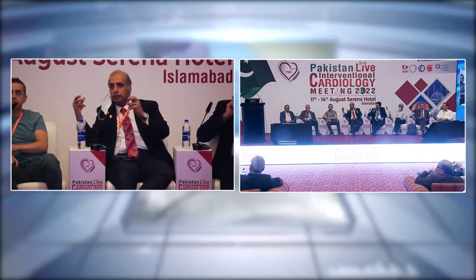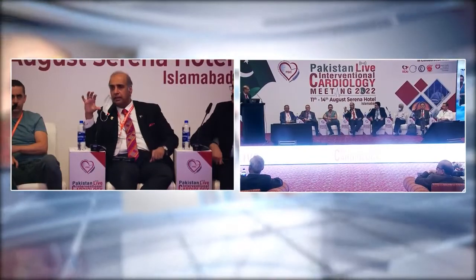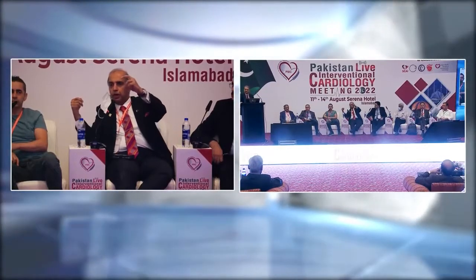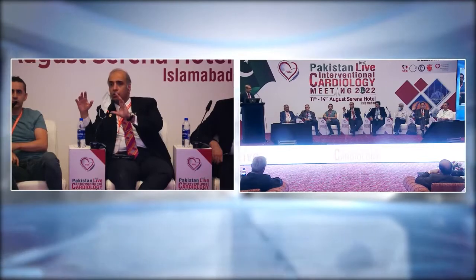Professor Harun, you're absolutely right. But when you are using dual injections and giving sequential injections, those lesions which are usually not that clear start becoming clear. Our experience is that whenever we give dual injections, we are mostly able to delineate very clearly how good or bad the lesion is.